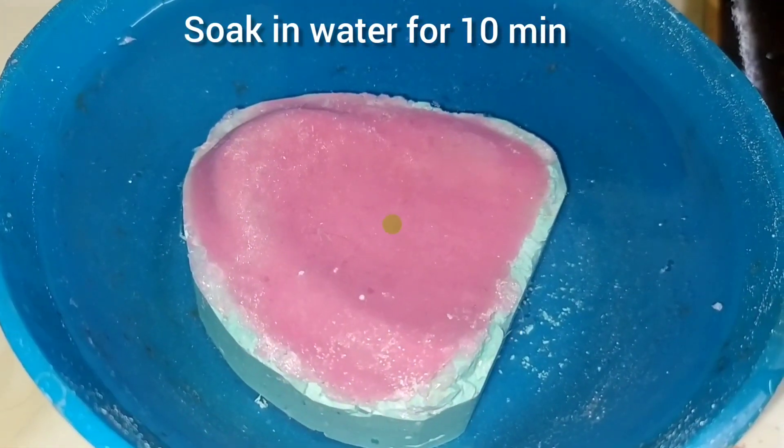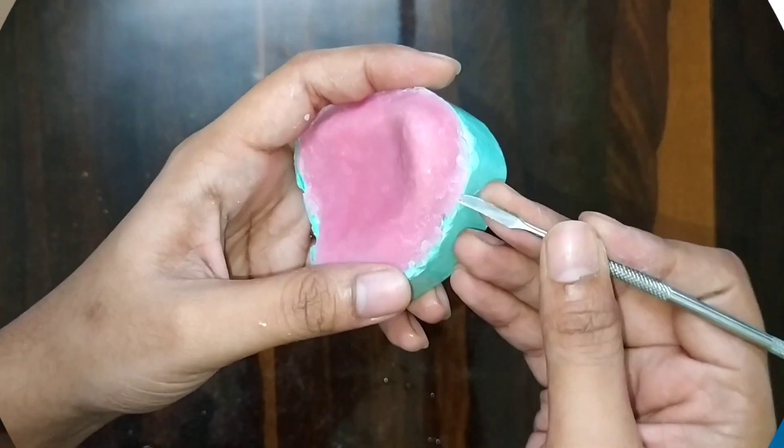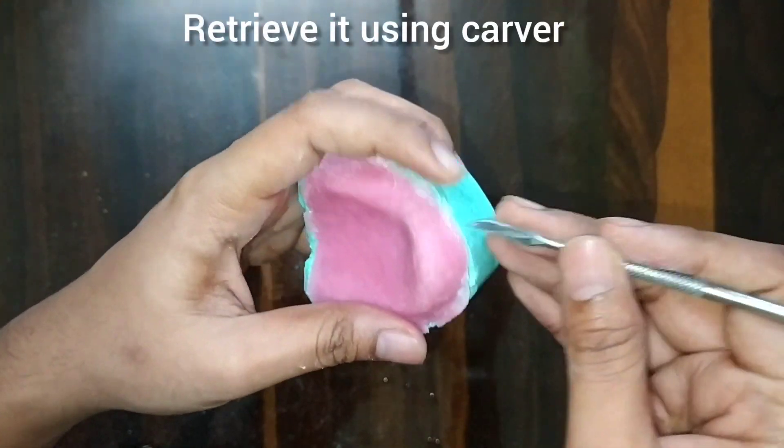After this, we will soak it in water for 10 minutes and then retrieve it using the carver.